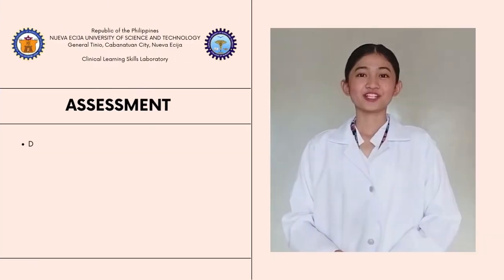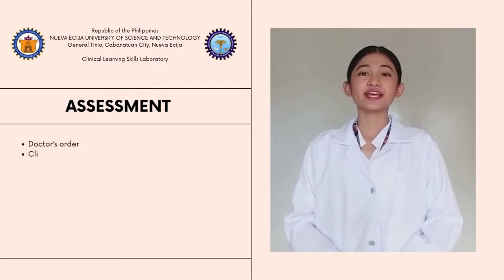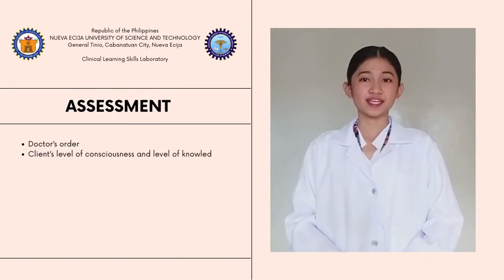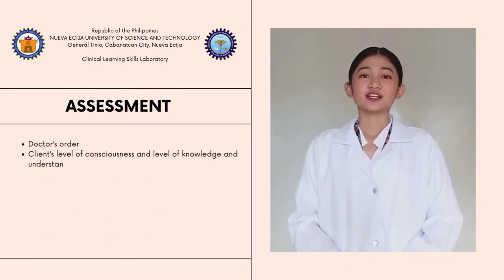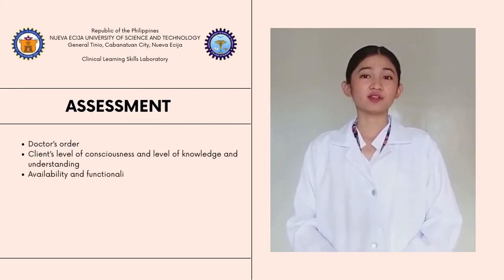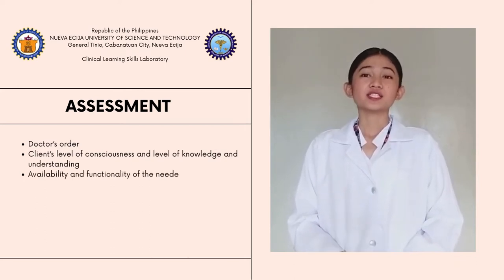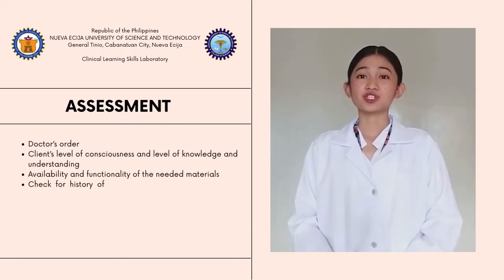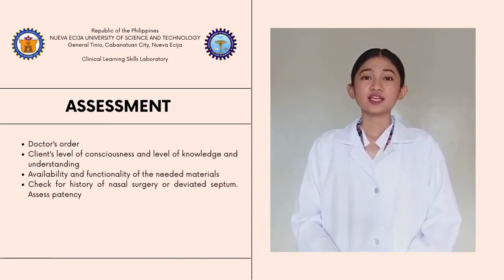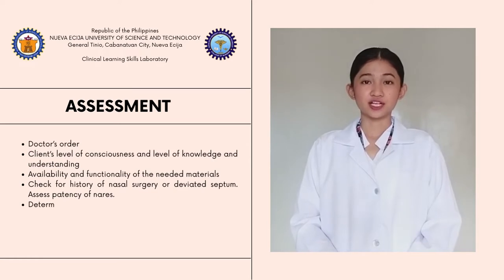Insertion. First, assess the doctor's order to identify the purpose of the procedure, as well as to ensure that we will be performing this procedure to the right client. Second, assess their level of knowledge and understanding of the procedure as well as their level of consciousness. Because as future nurses, we are responsible in ensuring that our clients are educated about the procedure and how it will be performed. Third, assess the availability and the functionality of the needed materials.